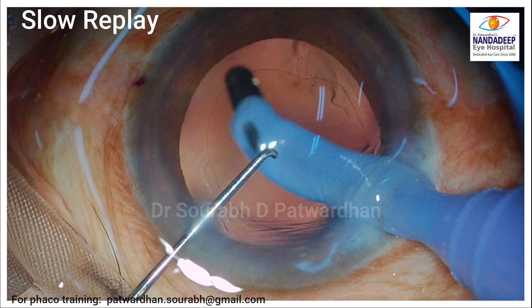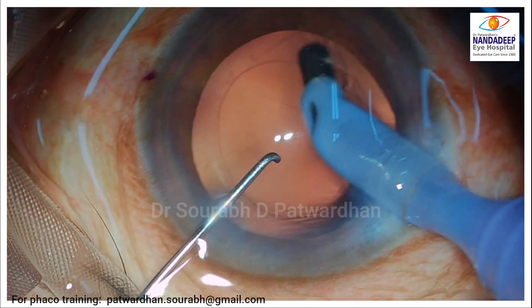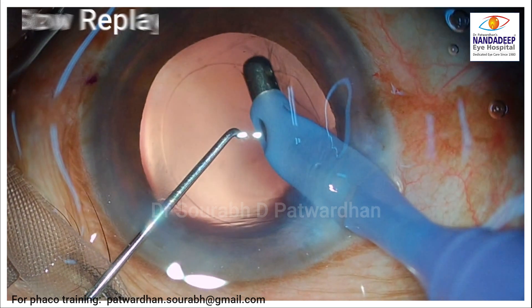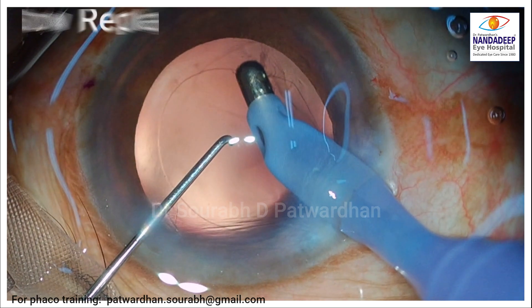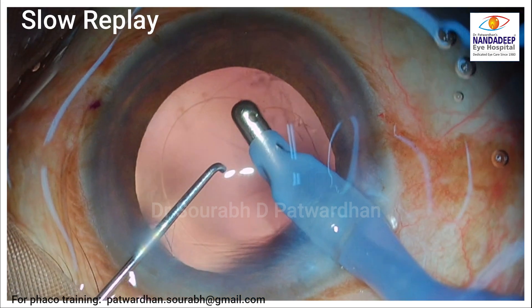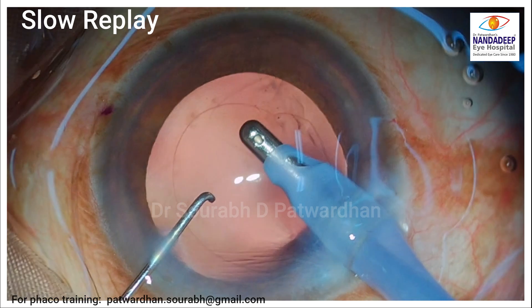The posterior capsule was probably a little bit more redundant. This happens if the anterior hyaloid is slightly detached from the posterior capsule. If the redundancy of the posterior capsule is there and the opening of the IA tip is towards the posterior capsule or sideways, it can catch hold of the capsule and tear it.